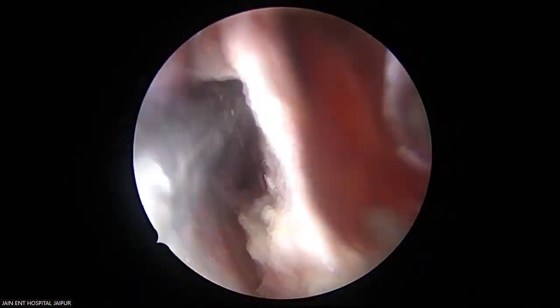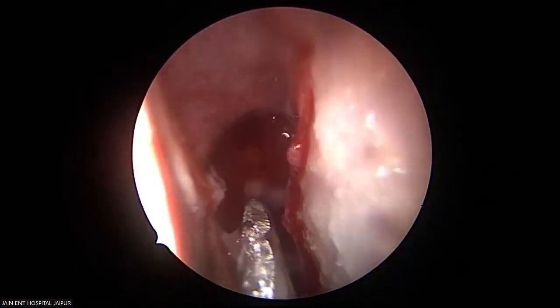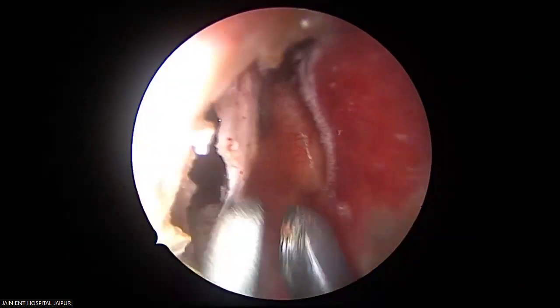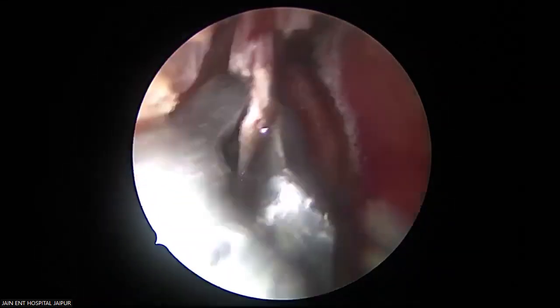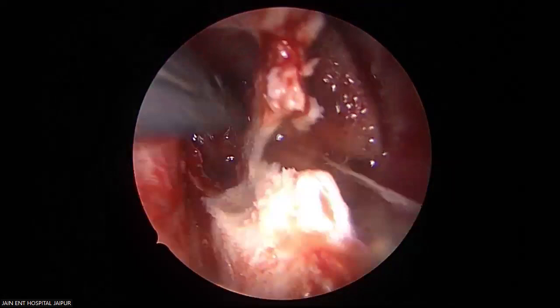See the opening? Yes, sir. See the level of the roof of the orbit behind? See the level of the floor of the orbit. Now, since I have thinned this bone, I can remove it, punch out. See this? Just behind is going to be the nasolacrimal duct.